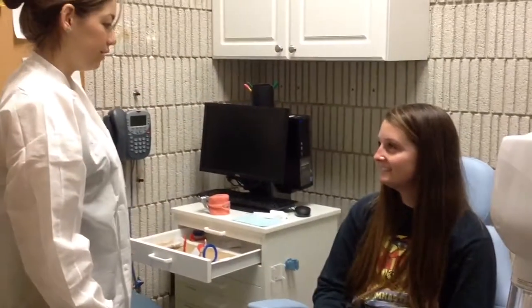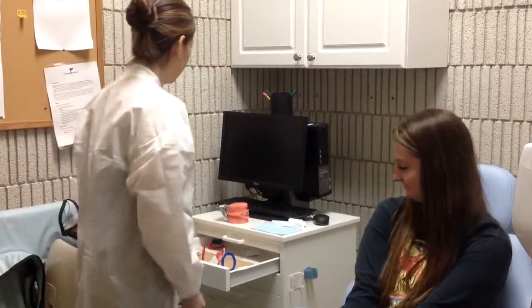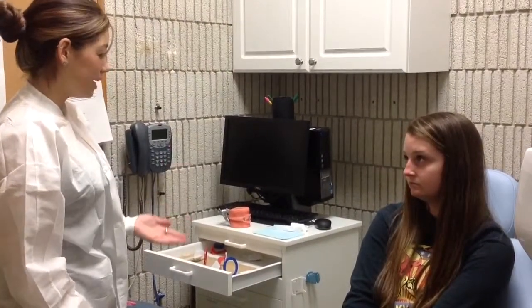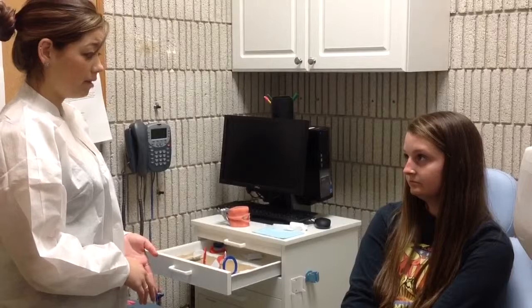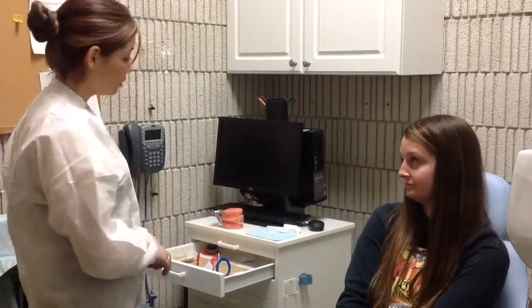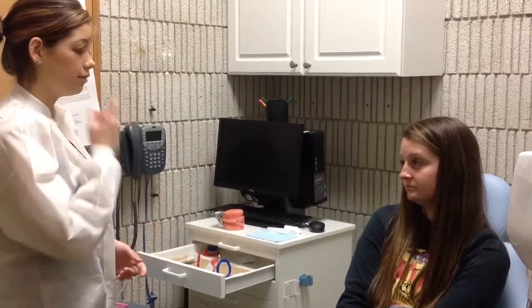Hi Erin, how are you today? Good. So I heard that you just had your cleaning. How did it go? Good. All right. So you haven't had pictures taken of your teeth in a while. We do call them x-rays. Do you remember last time you had them done, or do you ever remember having them done? I don't know if I've ever had them done. Okay, they are super easy. We have a few different ways to do it. We're going to take pictures of your front teeth.